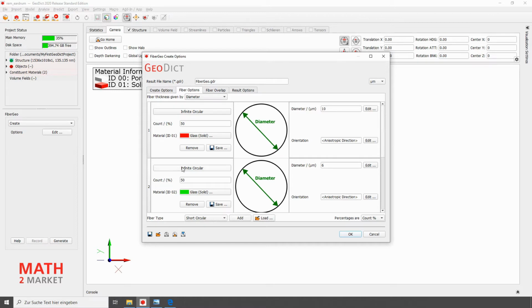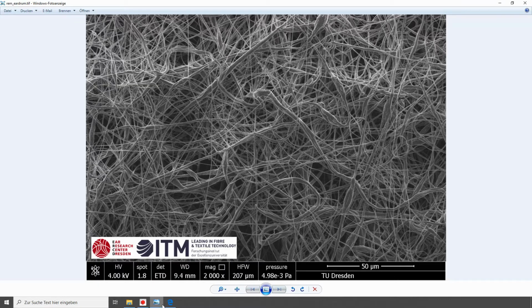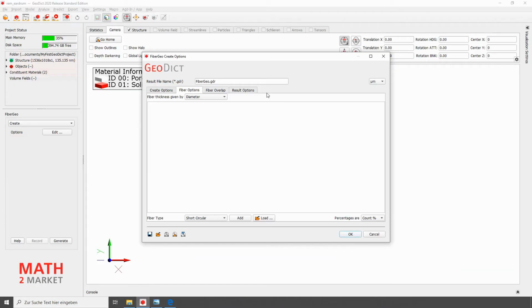By default, 2 types of fibers are selected. However, as these fibers are straight fibers, they are not suitable for our fiber structure. By clicking the Remove button, we remove them. To be able to choose the right fibers, we will have a look at the SEM picture again as a reminder. Although, as we can see, there are also straight fibers, there are also many curved fibers or fibers which are straight in sections and then curved again. We have to be aware of this when modeling our fibers.